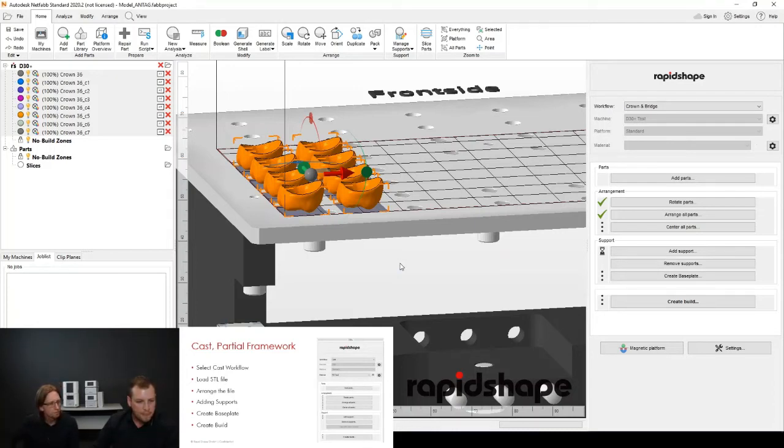We got another. Going to create build, not always attached. Customer. Interesting. Okay, I think in this case that would be something for our service department to check. On this special case, normally this is not something we observe.